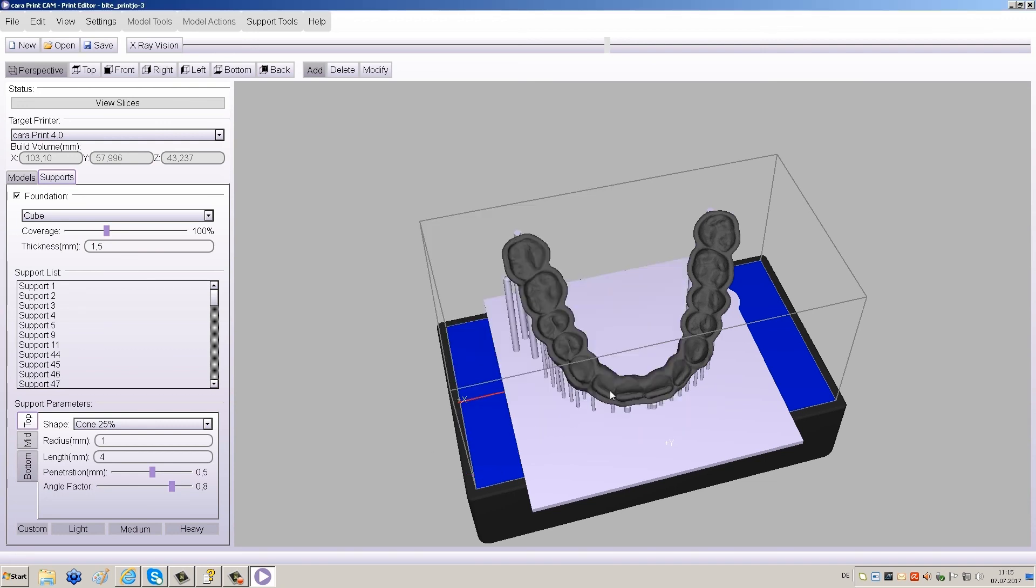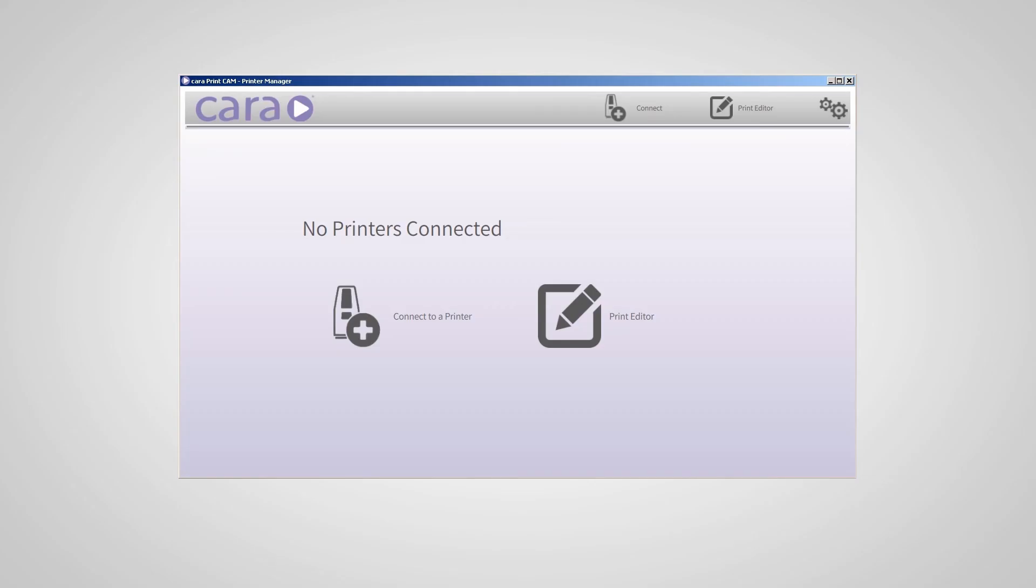Now you can close the project window and connect with CaraPrint 4.0 to print your file. There you go.